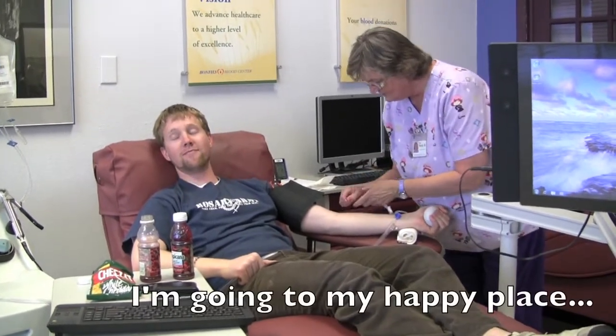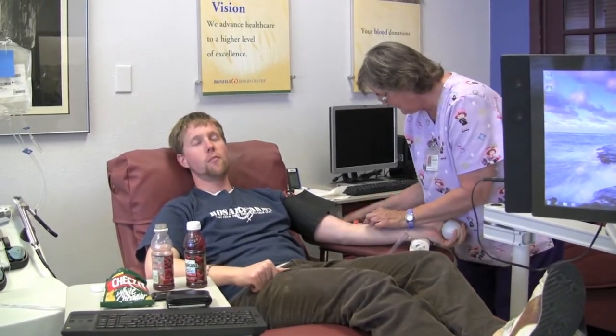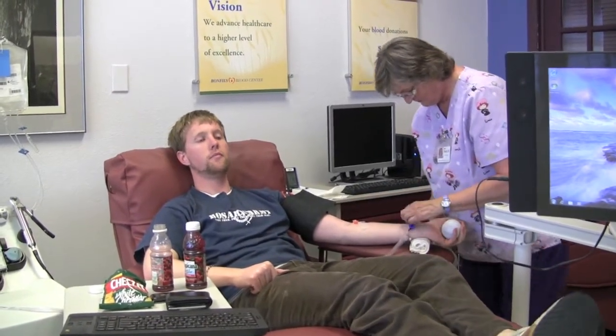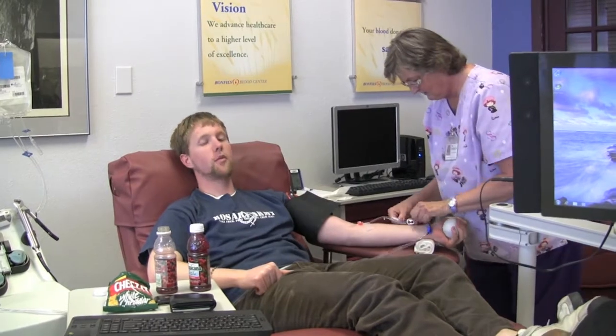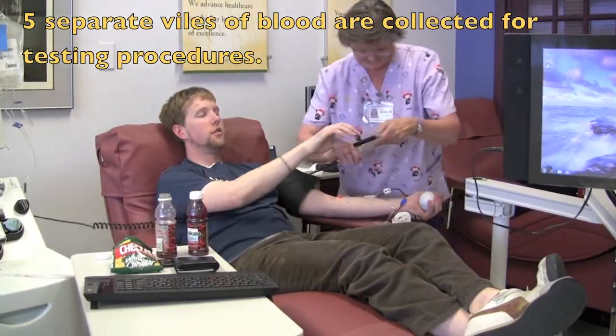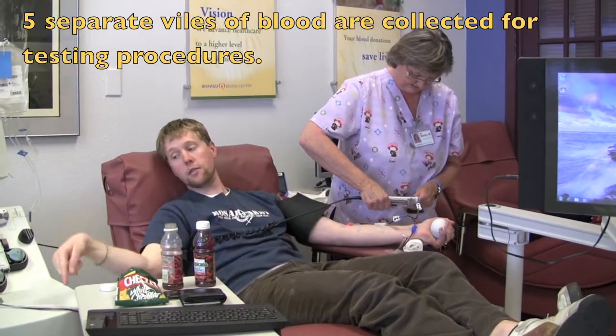So here we are right before the stick. So what are you doing with my blood right now? Collecting a sample pouch. So we're collecting samples for testing later on.